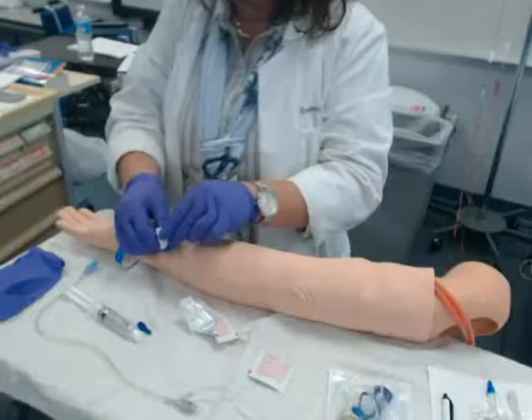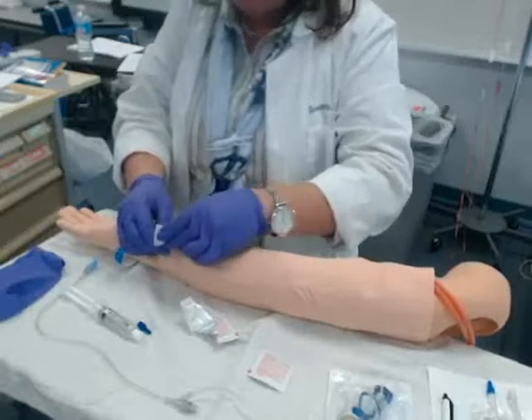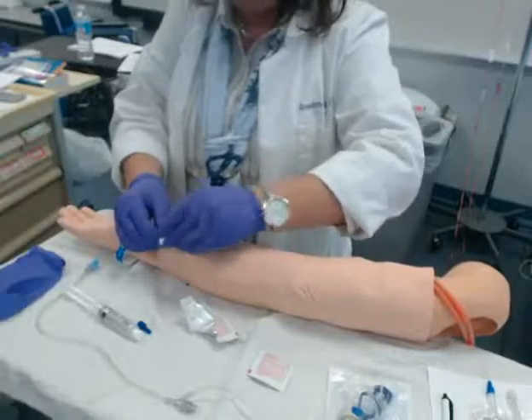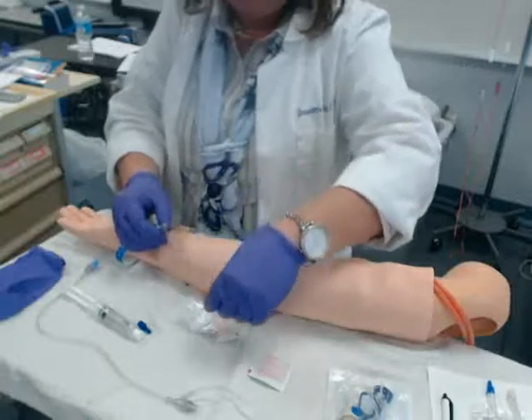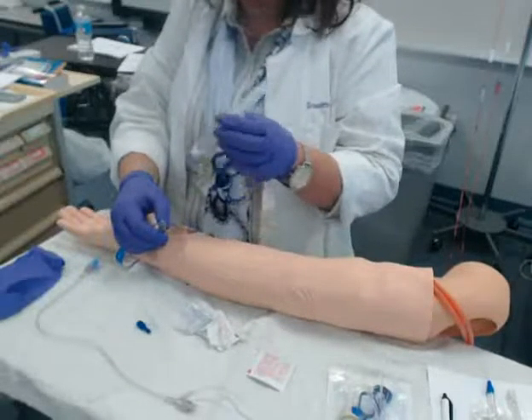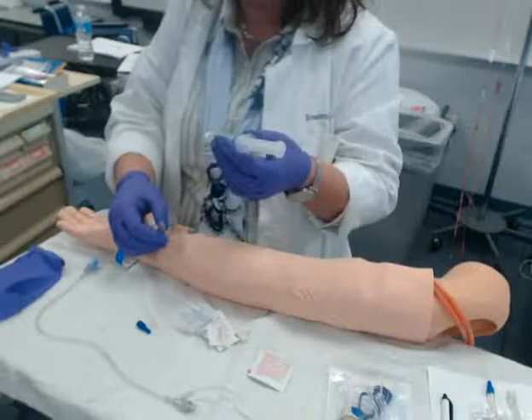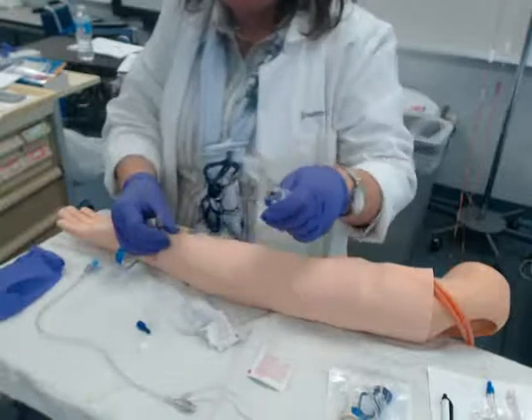Let me make sure you guys can see. All I need to do to flush is clean my port and use my saline flush. How much do I flush with? 5 mLs — that's correct. Open my alcohol. We always clean our ports every time we access them. Always. How we clean — this actually has threads on it. So we're going to wipe off the top and clean the threads — it has to be for 15 seconds. I'm going to count to 10.